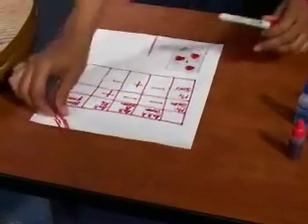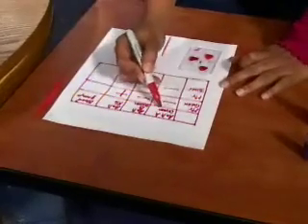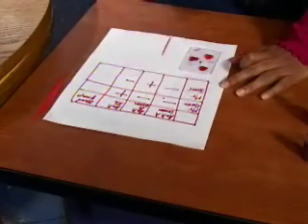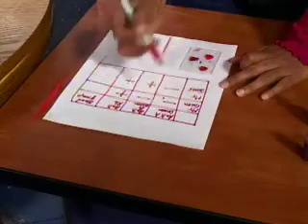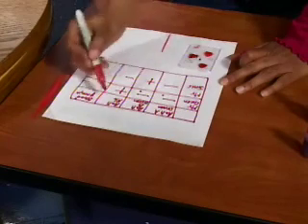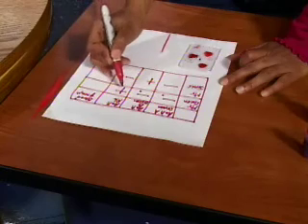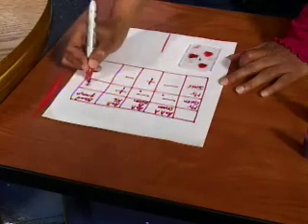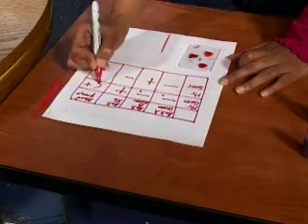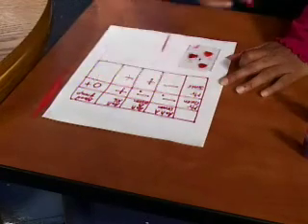Now let's determine the blood groups having done this. Now if there was no agglutination with anti-A serum, that means Mr. Green's blood did not contain antigen A. There was no agglutination with anti-B serum, that means it did not contain B antigen. But there was agglutination with the anti-RH serum, which means it did have the D antigen. So this is positive blood. Since it has no A antigen and no B antigen, it's O blood group. So this is O positive. Remember, blood group O has no antigens.